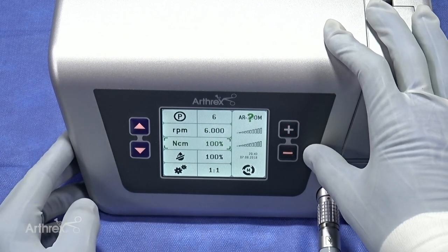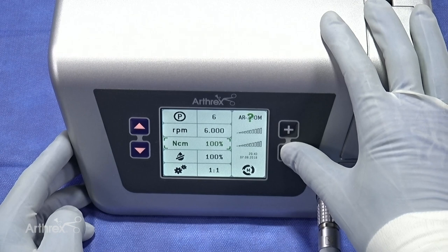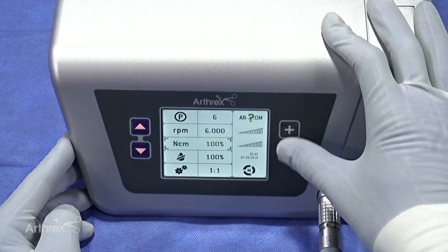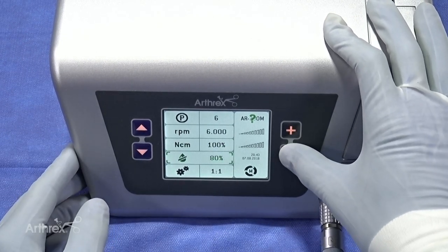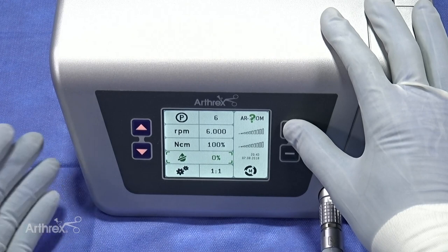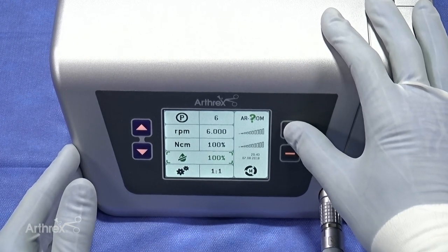This setting allows the surgeon to adjust the torque — if for whatever reason they didn't want as high a torque, they can adjust accordingly. For MIS settings, we'll keep it at 100%. The final setting lets the surgeon adjust the flow rate, which can be dropped all the way down to zero. So if they have the irrigation tubing set up but don't want the pump running, they drop this to zero, or they can increase it up to 100.